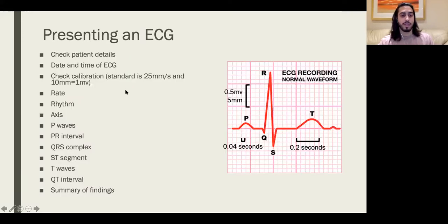That's just a note. But then we get to the real crunch and what we're actually looking for when we talk about ECGs. You want to calculate the rate, which we'll talk about, rhythm, axis. And now you kind of know what axis is, basically the direction the lead is going. But when someone says to calculate the axis of an overall ECG, they're basically talking about what is the overall mean vector of the action potential in the heart as a whole. So not one viewpoint, what we're looking at.